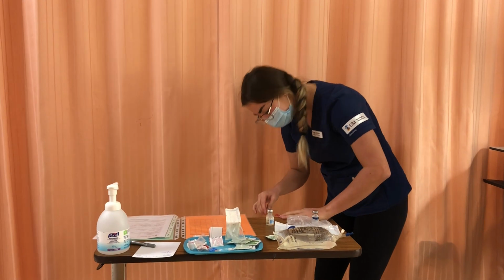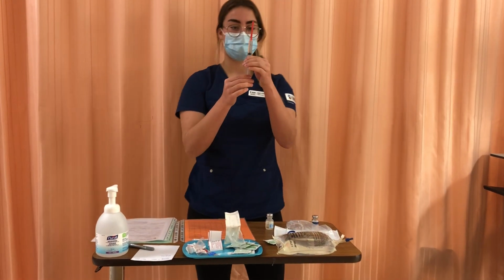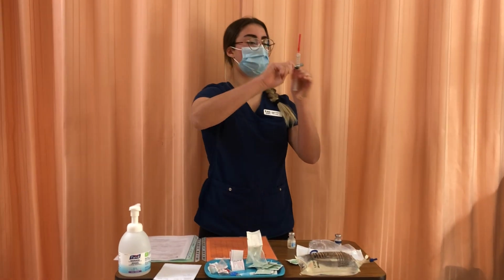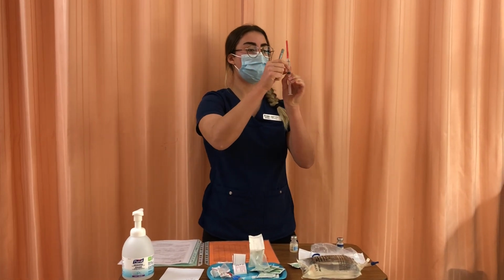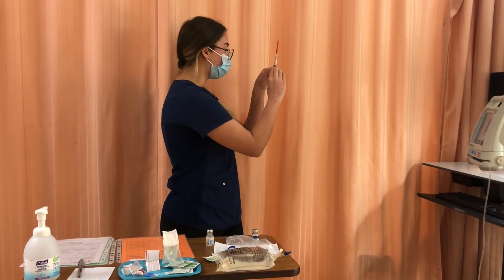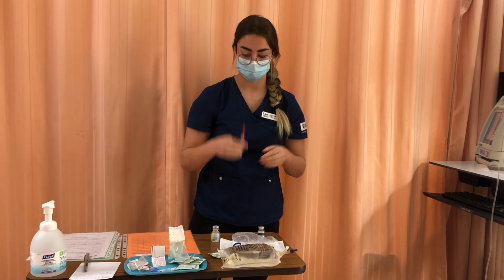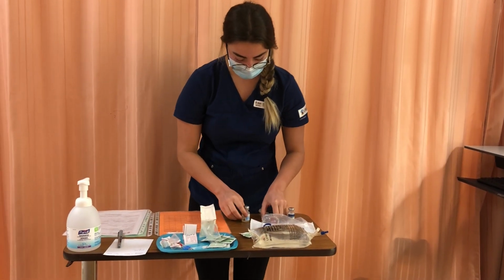And I'll recap. Pull back. And then tap out any bubbles, and then over a med waste container, I'll make sure that I have my correct dose of 4.8 milliliters. Then I'll come back, which I have here, 15 cc flush of normal saline to create a line of tubing.